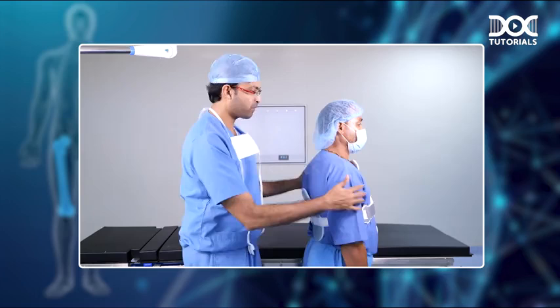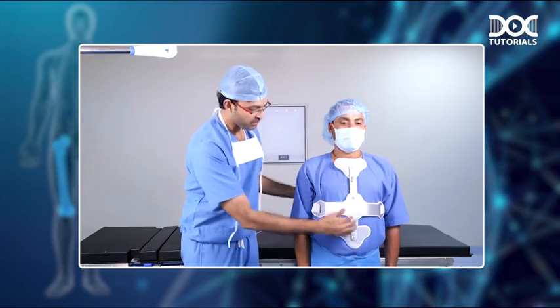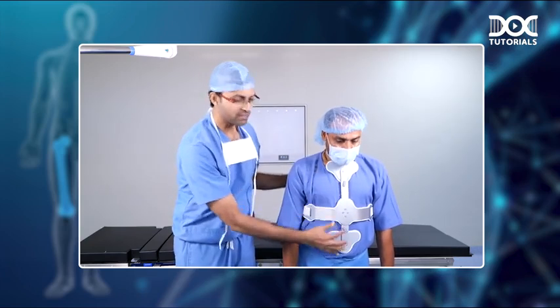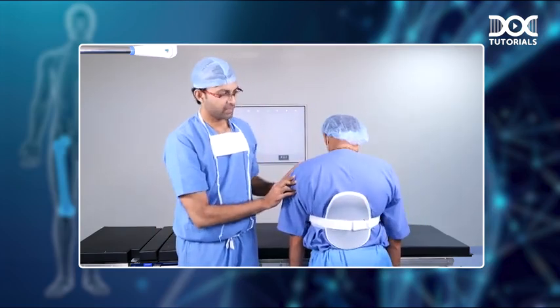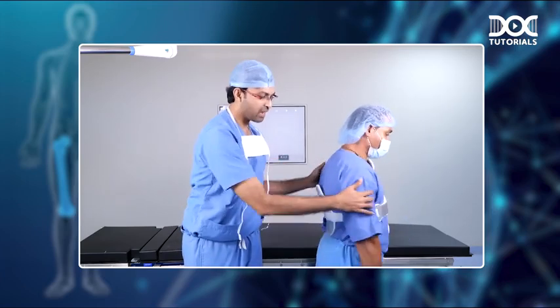So this is the view from front. You can see the anterior spinal hyperextension brace. You can see that the patient is not able to bend forwards. Why? Because of this restriction in the front. And this is what you see from behind. So this is your anterior spinal hyperextension brace or ASH brace.